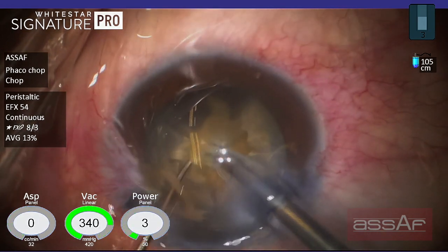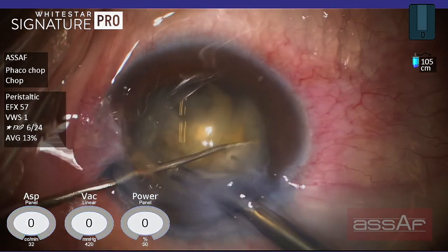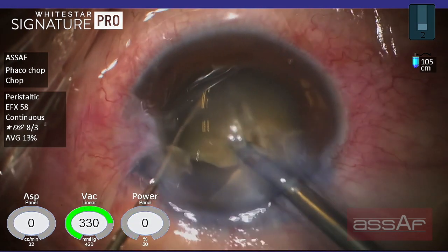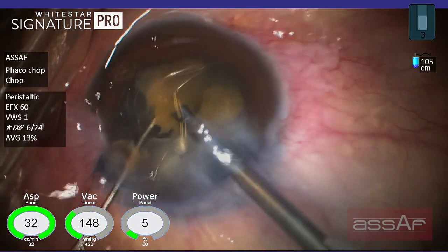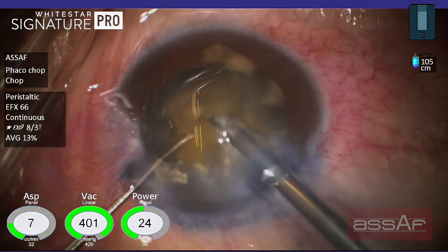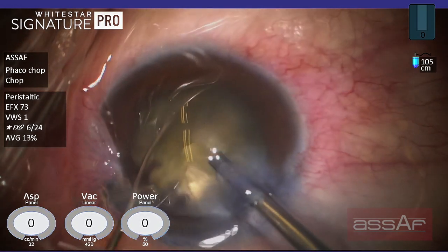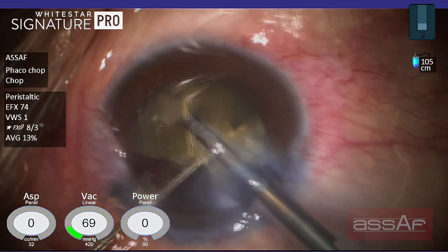The quadrants are still connected together. Finishing with one small piece of the cataract, rotating the nucleus again counterclockwise, now conquering the next quadrant which is still connected to the rest of the lens. Getting underneath this quadrant, elevating the posterior plate, applying a little bit of ultrasound to these cortical fibers connecting this quadrant to the rest of the nucleus to free this quadrant and emulsify it.